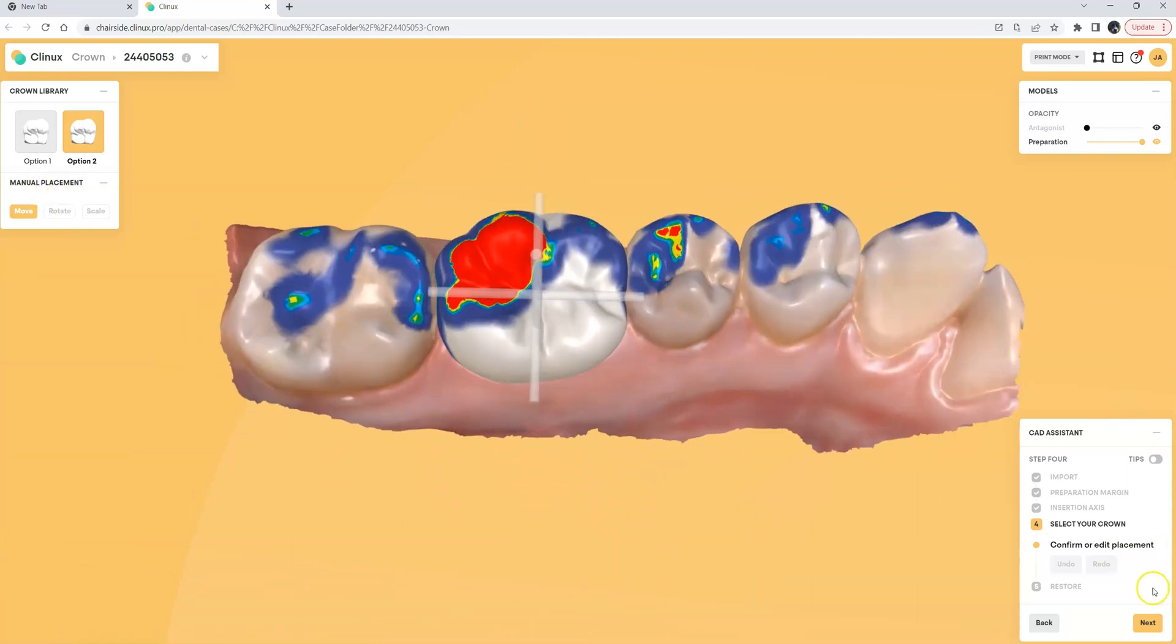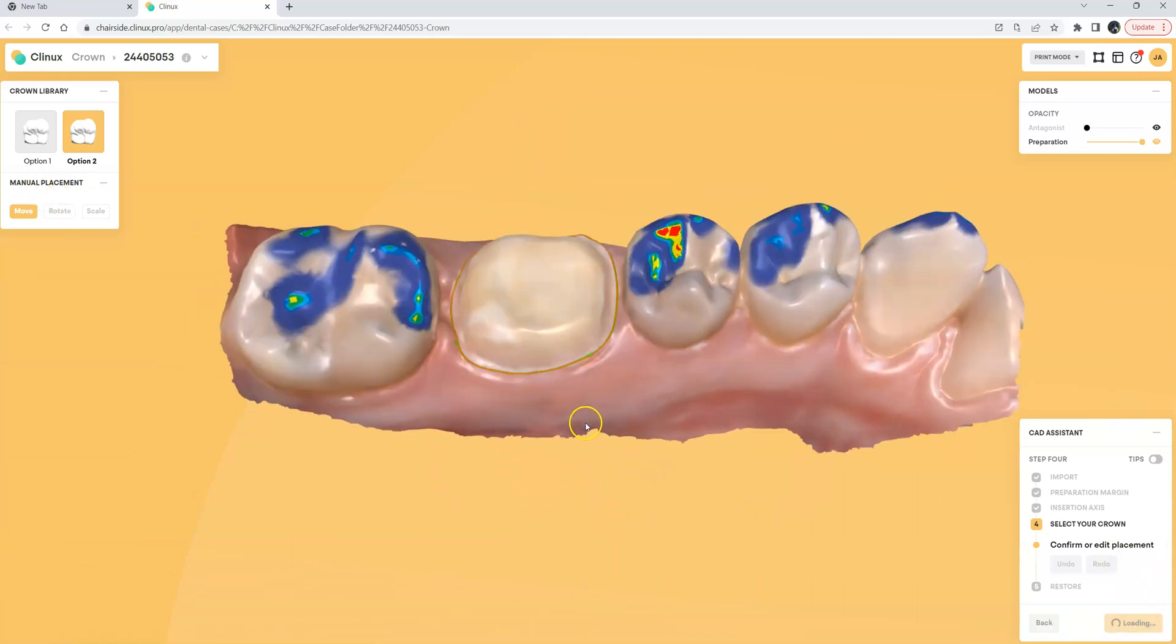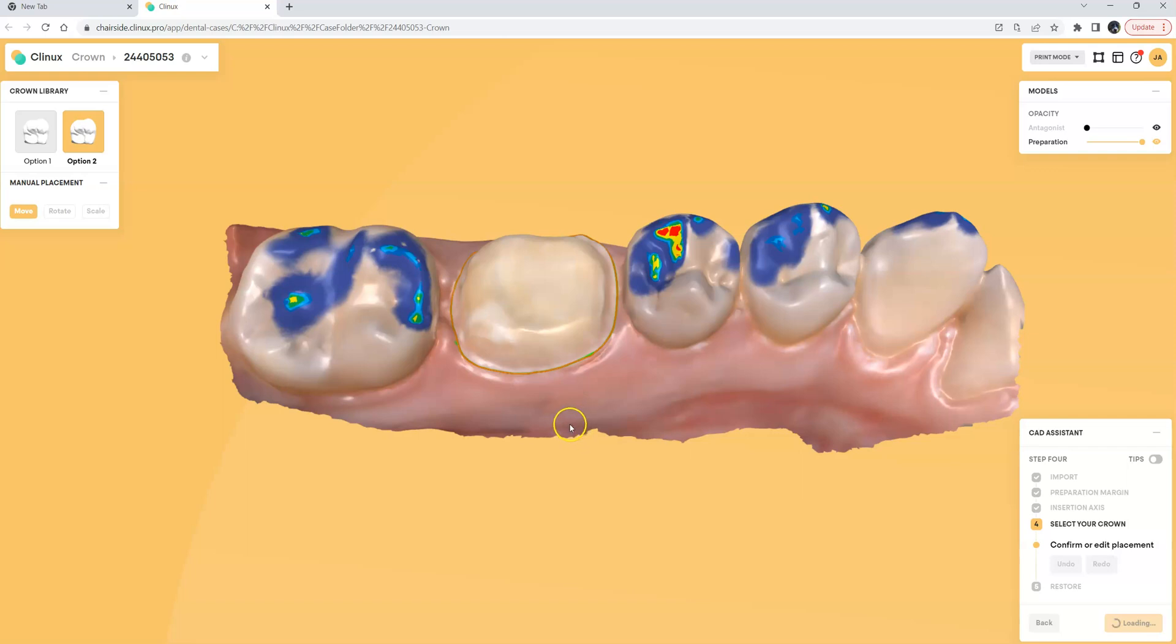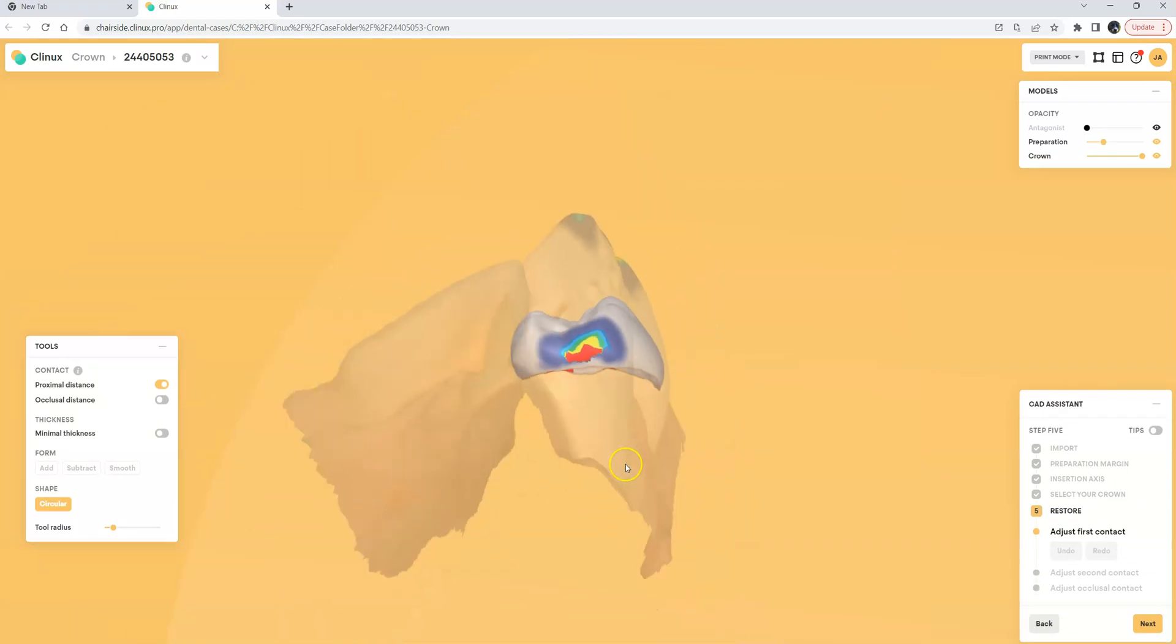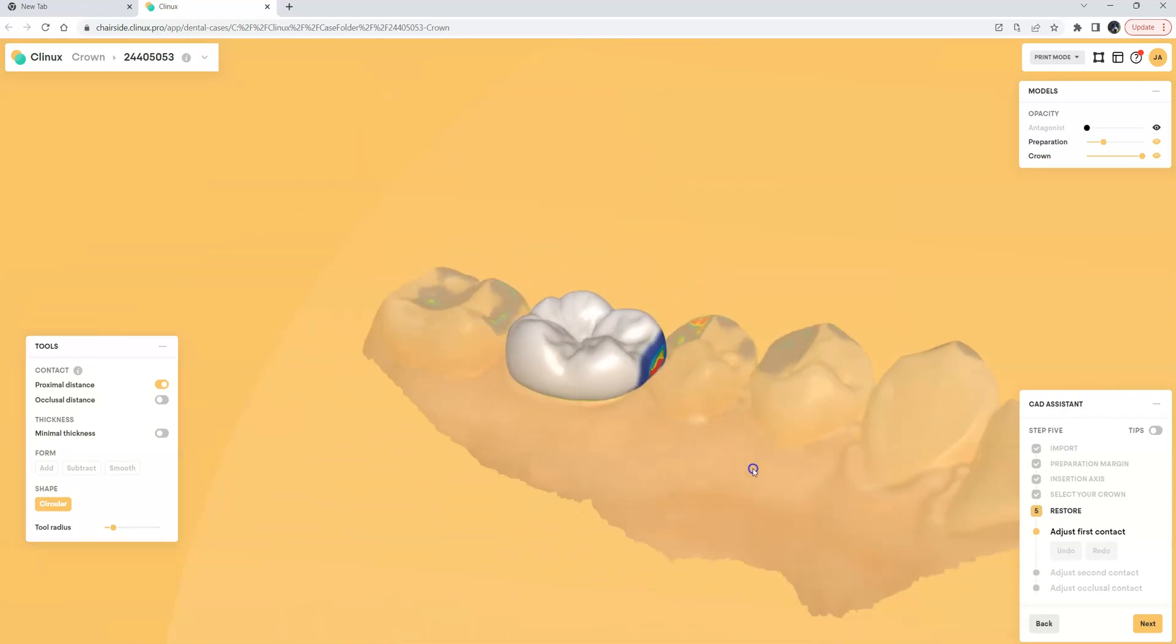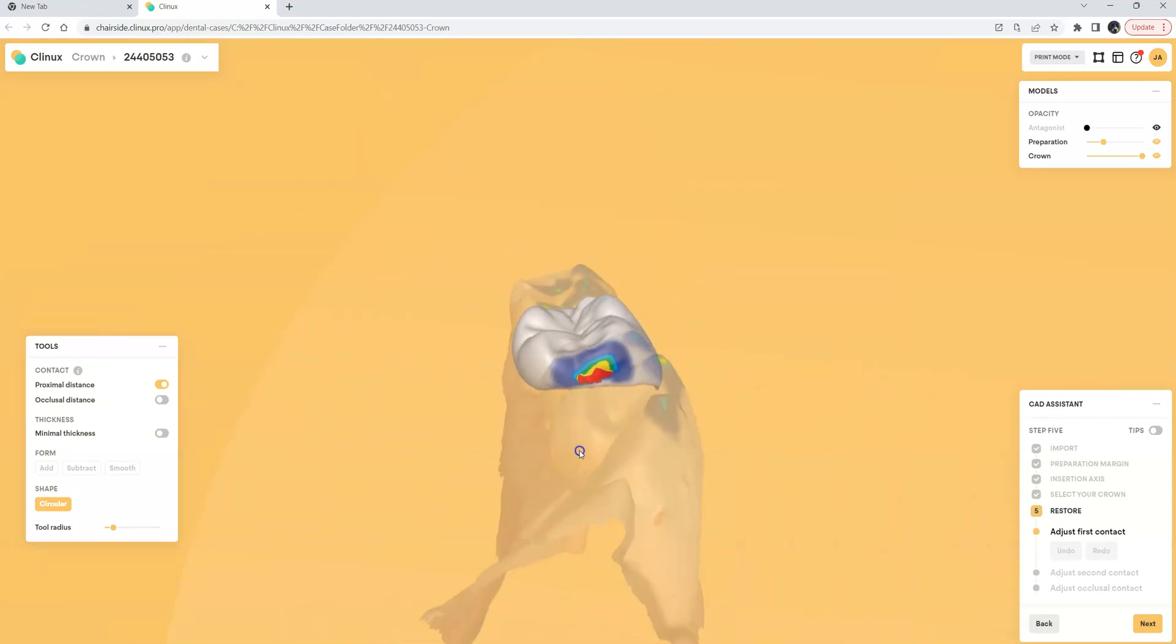Let's go ahead and click the Next button and we'll go ahead and get the proposal for the crown and we'll do some of the fine adjustments like the contacts in approximately and occlusally. So we'll wait a second here and we'll get the proposal for the crown and the first thing it's going to have me do is check out my proximal contacts.